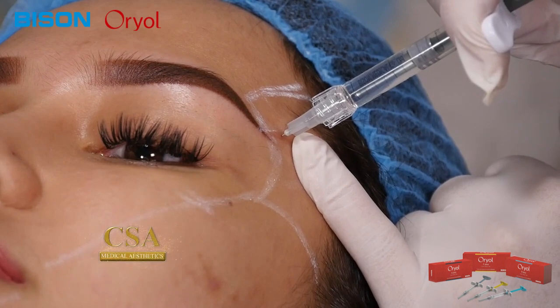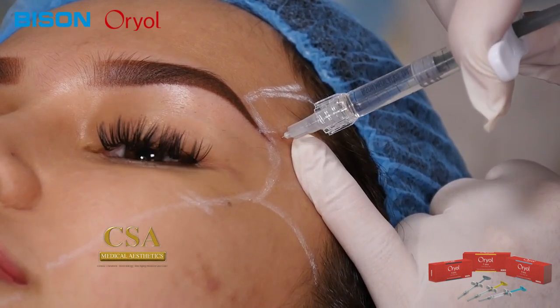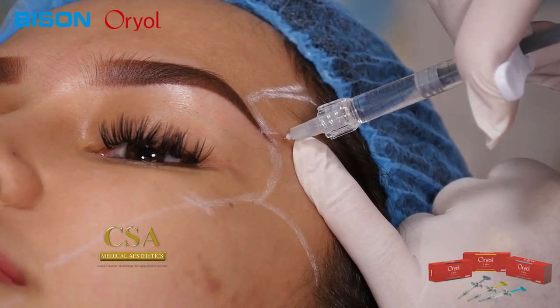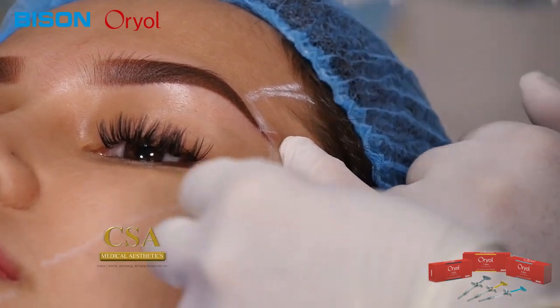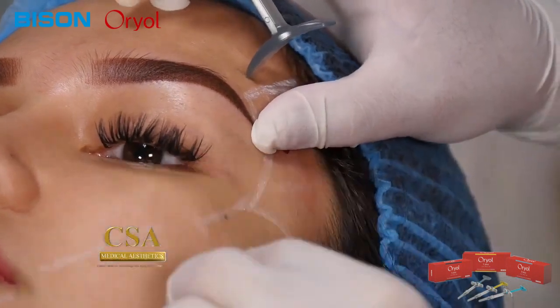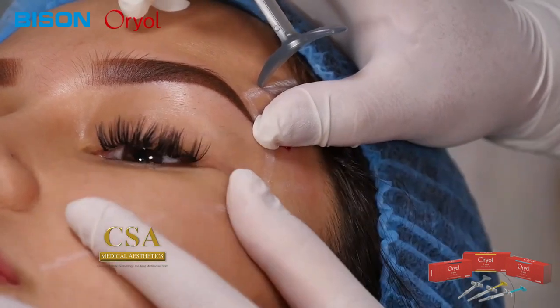Okay, so this is just correcting our volume loss on the temple region. Kim was telling me a while ago that it's more on the right side. Yes po. So later on, we'll be doing a so-called assessment, a balance check, and if we need to add more on one side that has more of a volume loss, we can still do that. And proceeding to my left zygoma, okay?